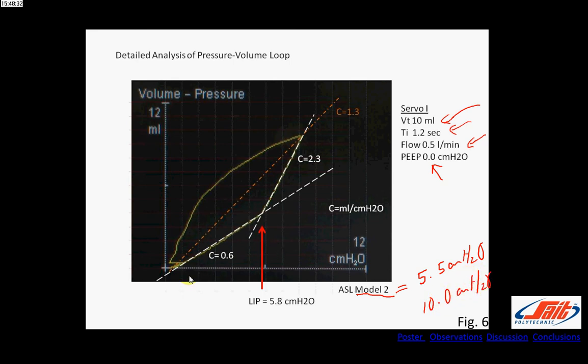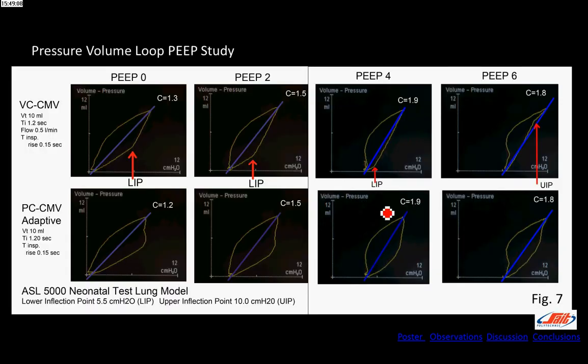All right. So you can see here with the low flow volume technique, I can actually draw the tangents and see this lower inflection point, and it seems to be pretty accurate compared to that ASL model. The compliance values here seem to be close to what I would have predicted with my ASL model. And we've got our average compliance. So this looks pretty realistic to me, and I do get to pick out that accurate inflection point. At least it looks to be so from the data that I have. So this is a detailed blow up of what you see actually on the ventilator.